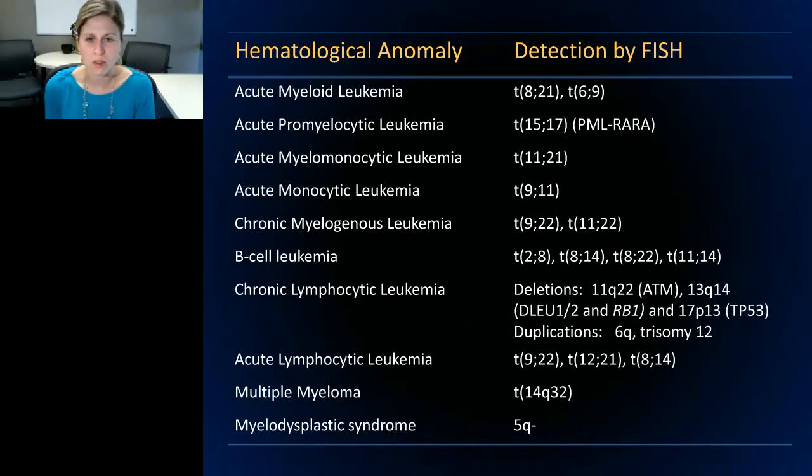Where we're using FISH is most commonly in hematologic malignancies, but it can be used in some solid tumors as well. With breast cancer and looking for HER2/neu, FISH can be used as well as a number of different immunohistochemistry methods. But typically, if we're talking about a molecular diagnostic tool, we're trying to look for the DNA, not the protein product. And then immunohistochemistry is looking for the protein product. So by using FISH, there are many different hematologic malignancies, fewer solid tumors that are actually going to be using that. But those are all listed here for your reference.